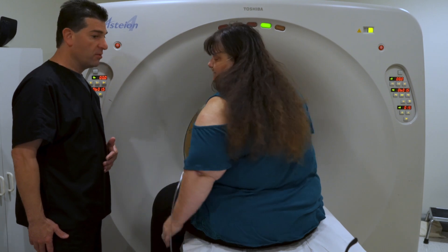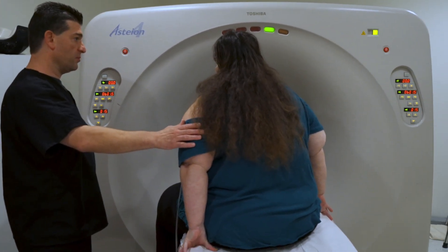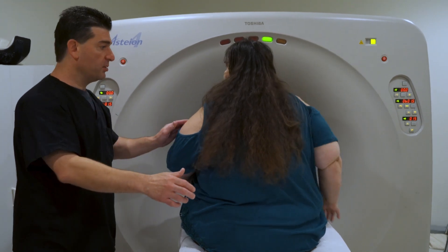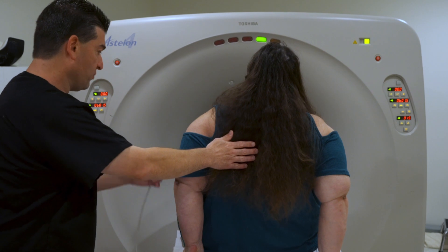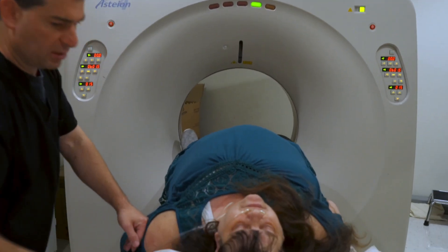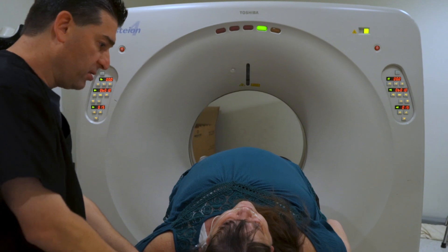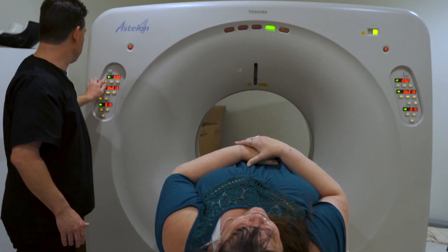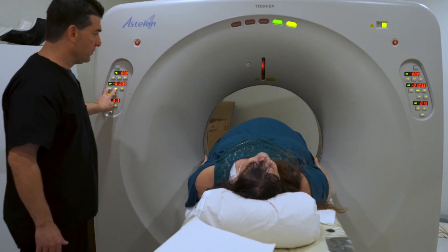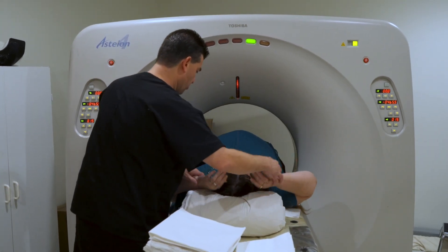Do you want to give it a try again? I'm going to put your glasses over here, OK? You're scared? Don't be scared. You never lay like that at home? I'll tell you, we'll be real quick with it. I can lift it up just a little bit more — lift your head up — and double the pillow for you. Is that better? Arm to your side. We're going to put your arm on the bottom of your head for this.